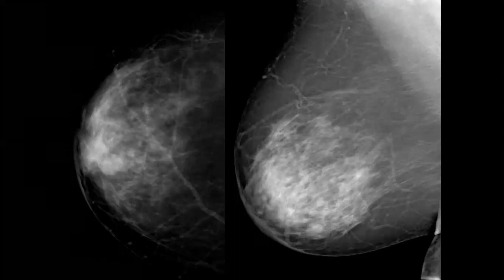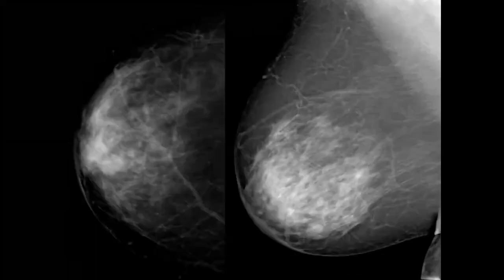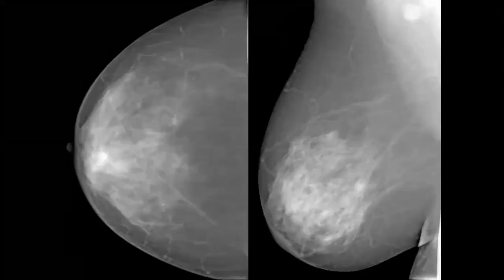This is the second round after 1 year. After 1 year, the area of asymmetry increased in size in the craniocaudal view. So still you will say asymmetry, and also retroareolar skin thickening. In the retroareolar there is increased density, so this is focal asymmetry.